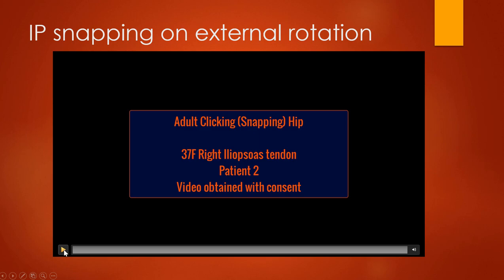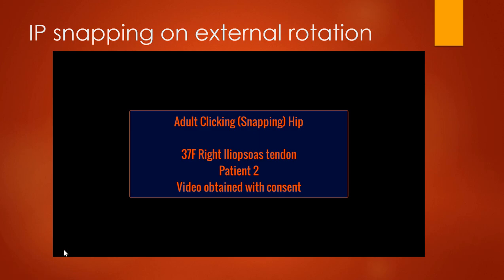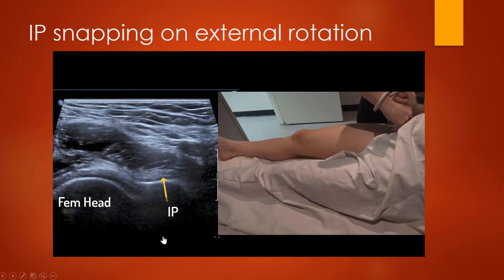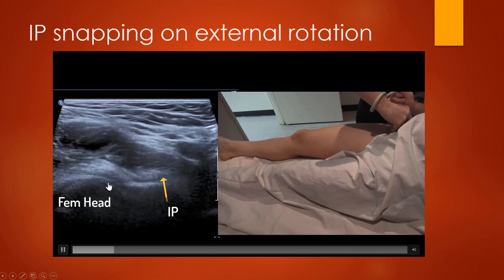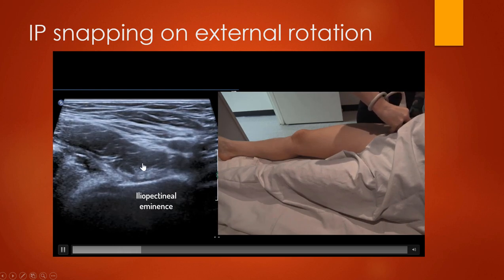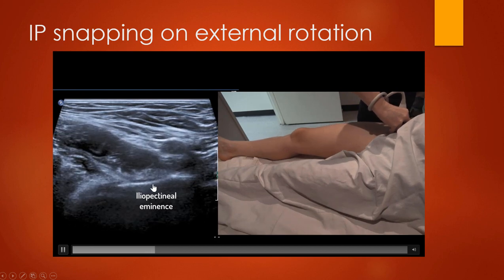In this patient, it occurs on a different part of the movement. So normally you get it when they're returning their leg back down to neutral, so in the breaststroke kick. In this patient, it's just slightly different. So we can see our landmarks here, the rainbow sign. We're moving just above that, and you need to angle up slightly so that we see that tendon echogenic.